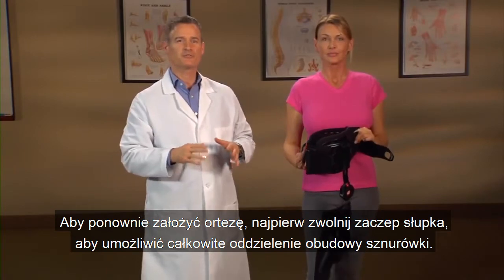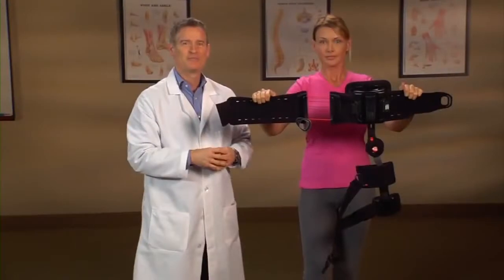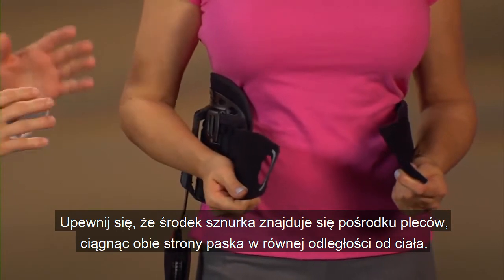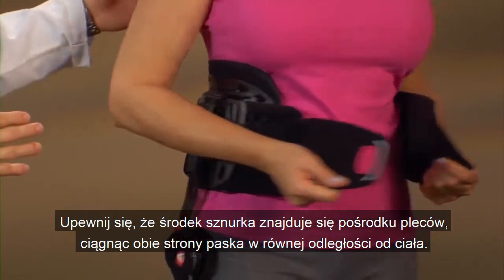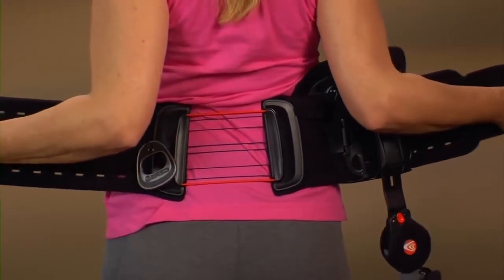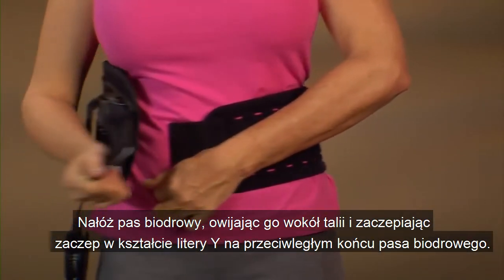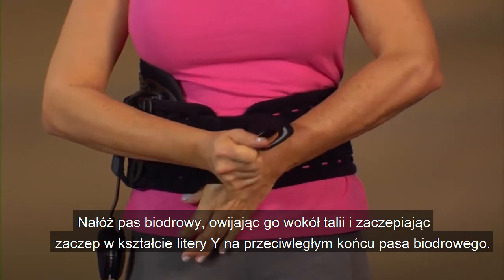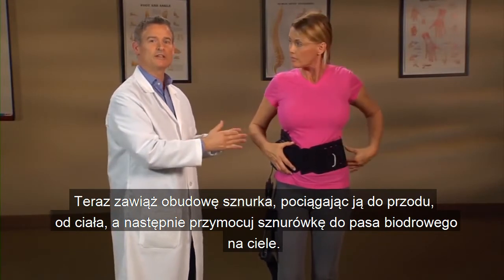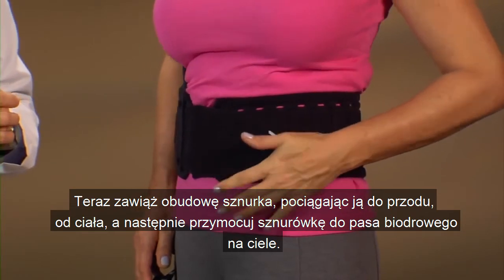To reapply the brace, first release the pull tab to allow the lace housing to be fully separated. Position the waist belt at approximately the navel level. Make sure the center of the lace is in the middle of your back by pulling both sides of the belt an equal distance away from the body. Apply the waist belt by wrapping it around your waist and affixing the hook end Y-tab on top of the opposite end of the waist belt. Now tighten the lace housing by pulling the lace pull forward away from your body and then secure the lace pull to the waist belt across your body.